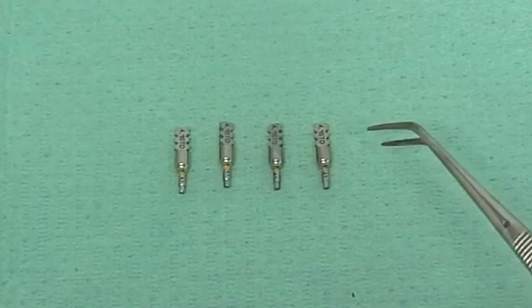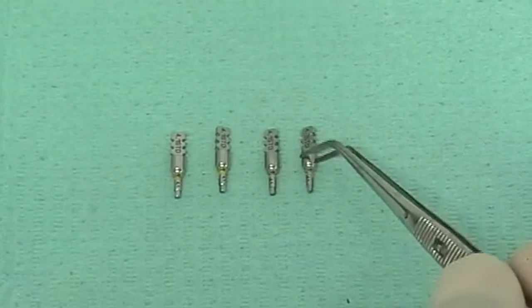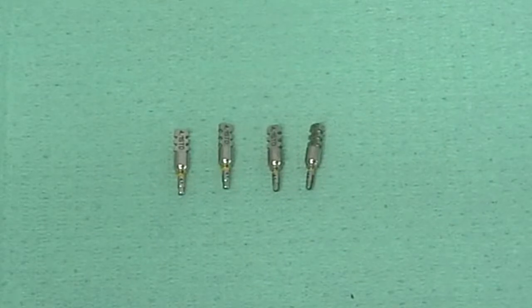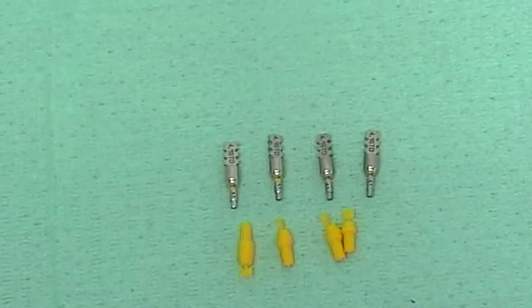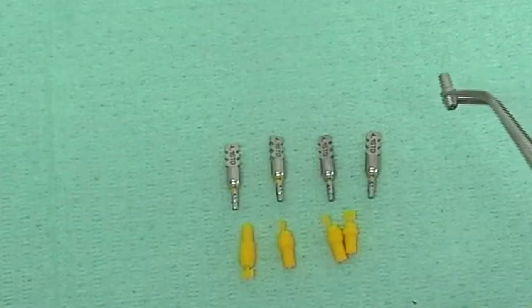Two weeks ago I took an impression with four standard transfers acquiring the position of four osseointegrated implants. My technician poured up a dental cast in order to choose, with the help of try-in abutments, the appropriate abutments. For this clinical case he has chosen three straight abutments with a gingival height of three millimeters and one angled abutment.